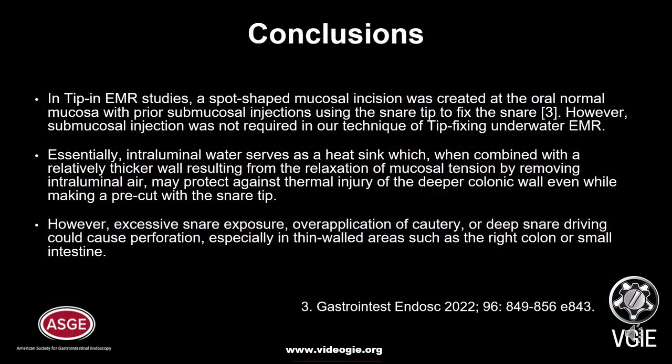In conclusion, in tip-fixing EMR, a spot-shaped mucosal incision was created on the oral normal mucosa with prior submucosal injection using the snare tip to fix the snare. However, submucosal injection was not required in our technique of tip-fixing underwater EMR. Essentially, intraluminal water serves as a cushion which, when combined with a relatively thicker wall resulting from relaxation of mucosal tension by removing intraluminal air, may protect against thermal injury of the deeper colonic wall even while making a pre-cut with the snare tip.